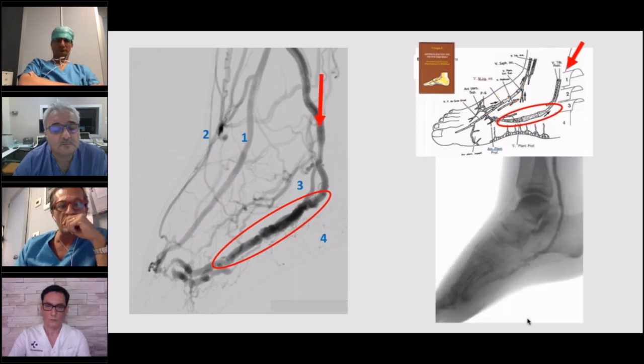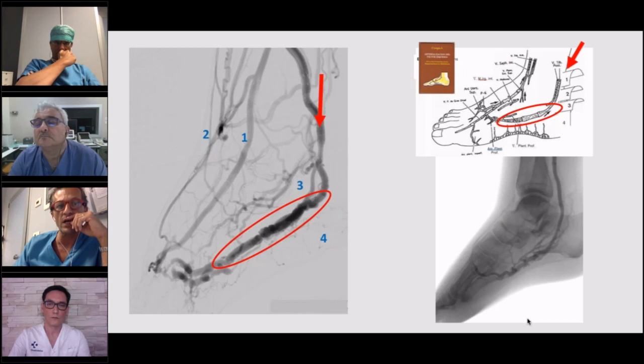This is the first concept to know well, because based on this anatomical concept we understand why the best way to obtain arterial flow into the foot venous network, in totally percutaneous arterialization, is the posterior way through the deep plantar level.